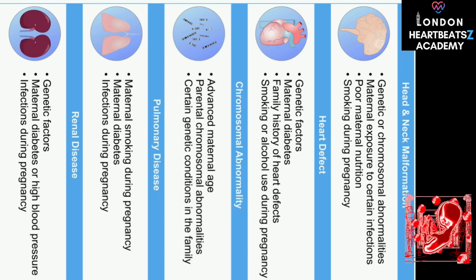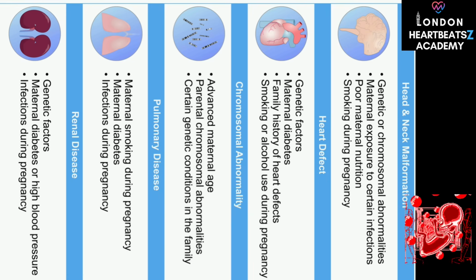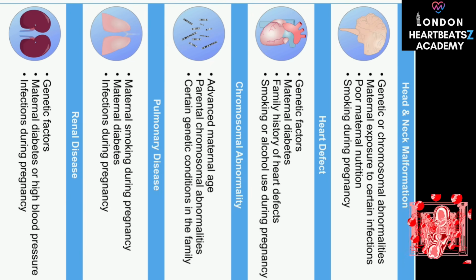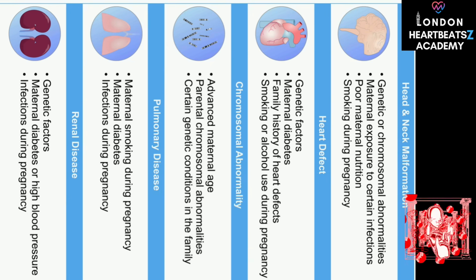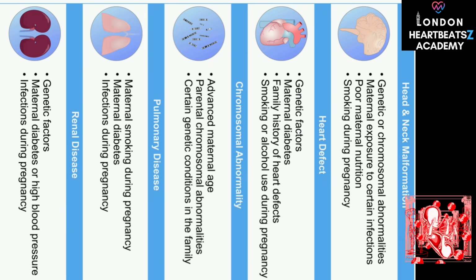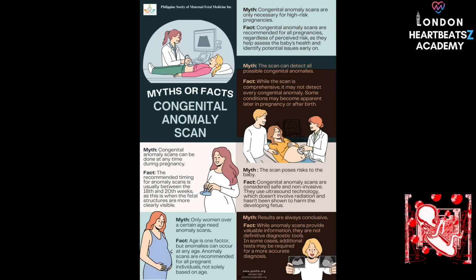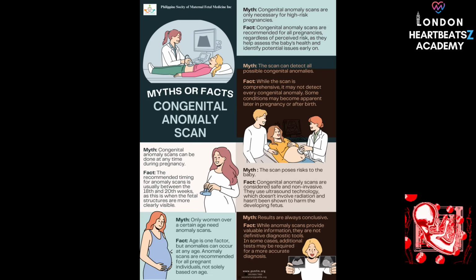Exactly. And what are the main goals? What are the sonographers and clinicians hoping to achieve by doing this scan? Well, the objectives are quite comprehensive. The primary goal is a really detailed evaluation of fetal anatomy, a systematic check of all the visible structures. This leads directly to the next goal. Detecting structural anomalies, basically identifying if any part of the fetus hasn't developed in the expected way. It's about determining normalcy, confirming that structures appear typical for the gestational age.